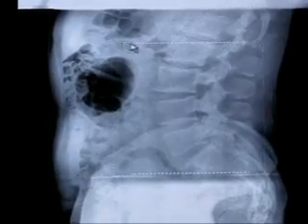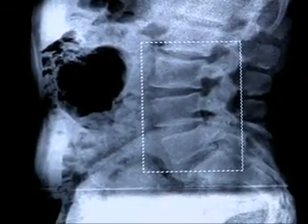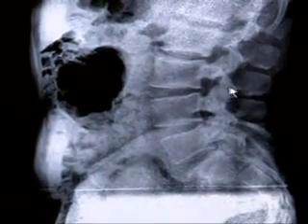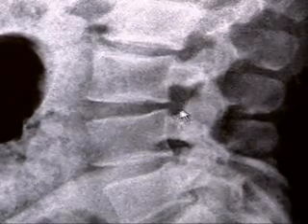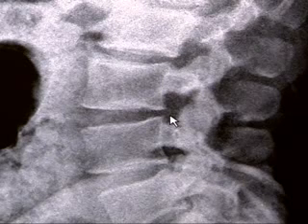But now if we take it and we crop it down, instead of retaking the film, look at this, we darken this up, and we can actually see a glaring problem here where this young athlete has what we call a pars defect, or a fracture right here in the posterior aspect of his spine. And this allowed me to refer him immediately for an MRI, and we found out through the MRI that he has this on both sides. He has a bilateral pars defect.